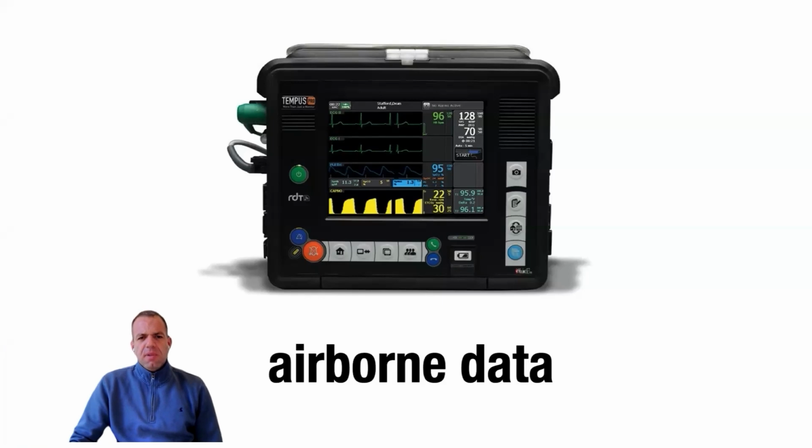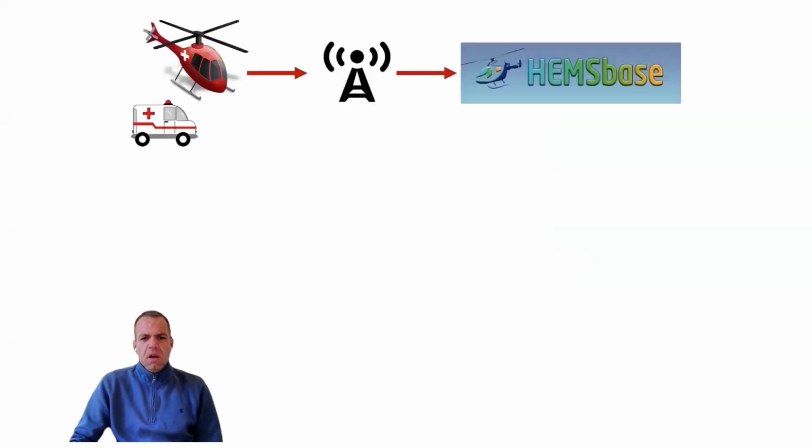Now, what we've done on KSSMs is really take this to a new level. What I like to think about the Tempus is our airborne data station. So the Tempus is equipped with several SIM cards, which allows it to connect to the cellular telephone network. And actually, we have pretty good coverage. Even when we're buzzing around at 1,000 feet, we manage to get good connectivity.